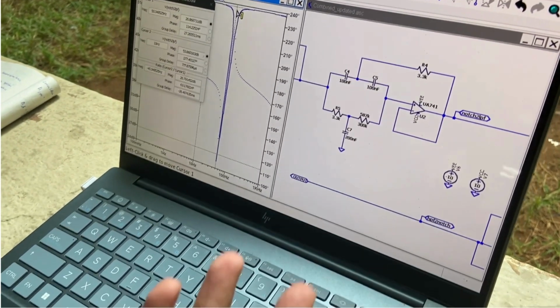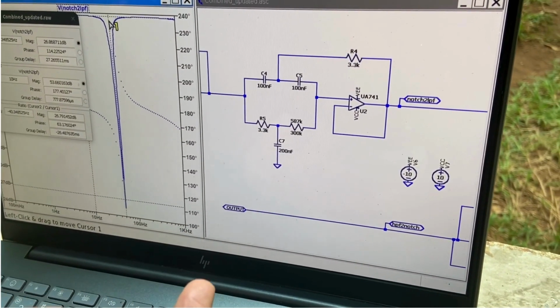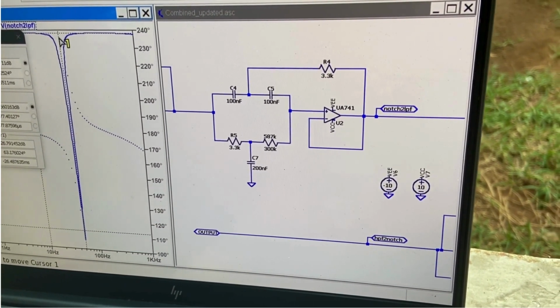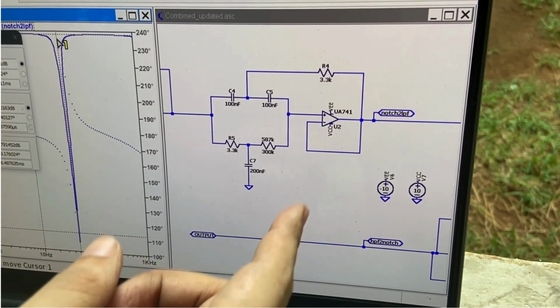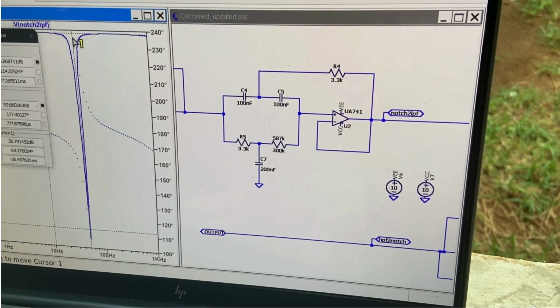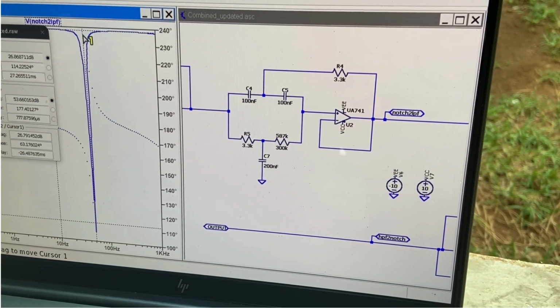So the next part after the instrumentation amplifier is the notch filter. The basic purpose of the notch filter is to remove the 50 Hz noise coming in from the AC supply voltage in India. The current implementation which we are using has a parallel T structure. It's a second order notch filter, and we have designed it for a quality factor of 8 and a cutoff frequency of around 50 Hz.